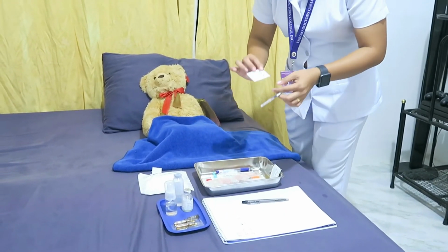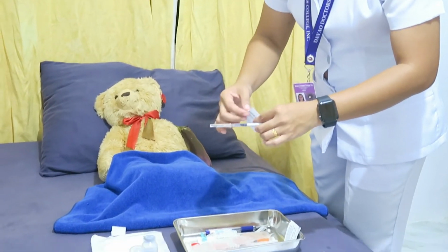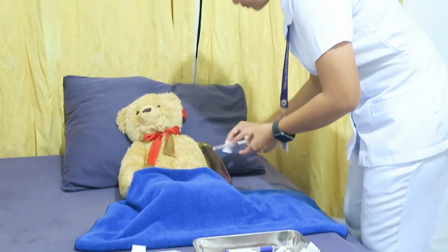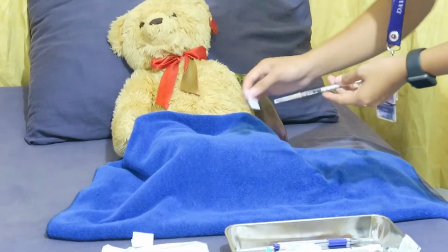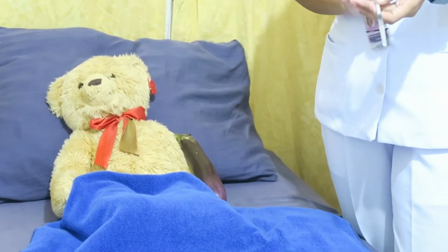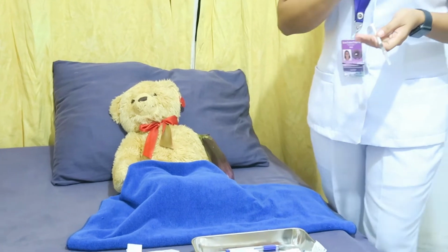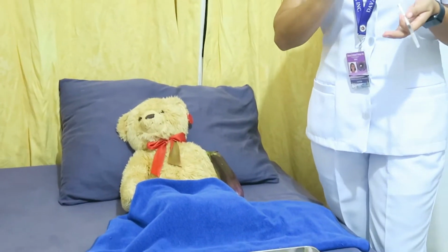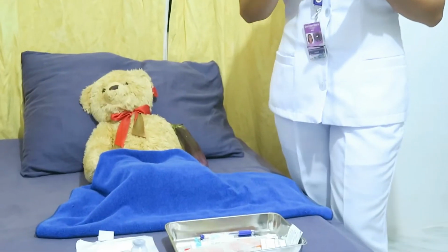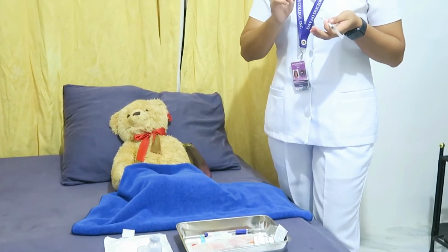I will use the alcohol pad to cleanse the site. Next is to select a site. So this, the forearm about a hand's width above the wrist and 3 or 4 finger widths below. Avoid using sites that are tender, inflamed, or swollen, and those that have lesions.